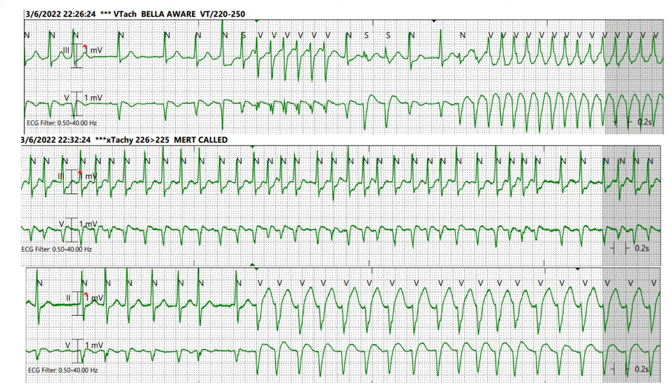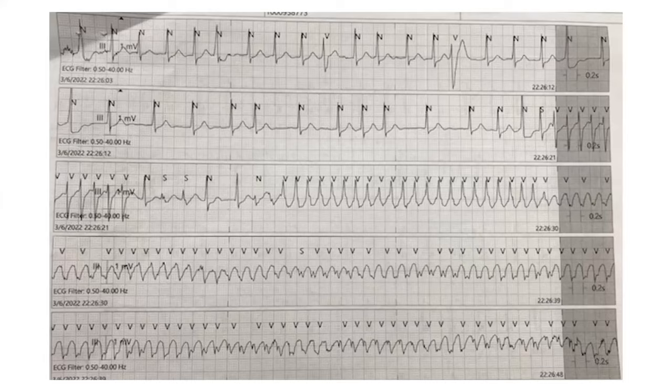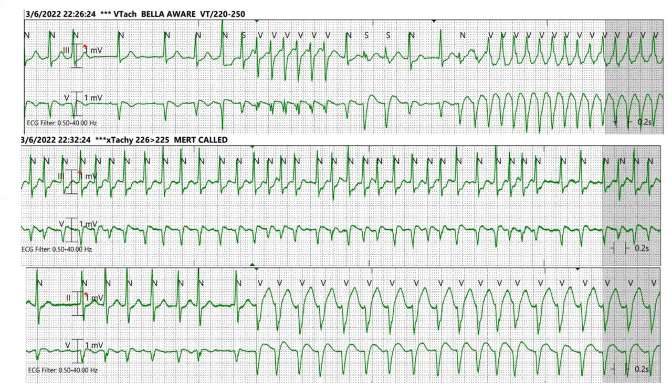Yeah. So can I ask all the young doctors, why are you just talking about this ECG? There is a reason for it. We can just pass by and call it AFib with RVR, or make our brain think. And that is the whole point that we are trying to do here, that you don't ignore anything. You don't just pass by, saying hey, this is AFib with RVR, and then go away. The day we start doing that is the day we are going to miss VT, which will become disastrous for the patient.